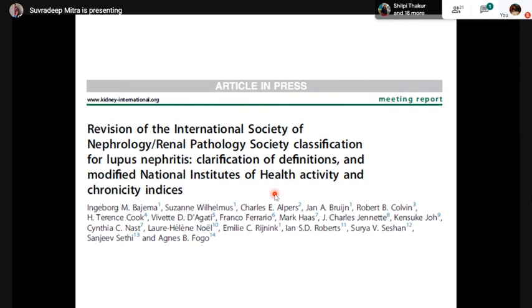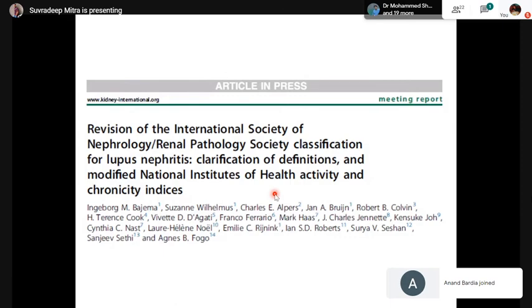So with this, let me tell you that lupus nephritis is histopathologically classified into 6 classes. The first class is the minimal mesangial, which means that morphologically you barely see anything. It's kind of normal morphology. However, when you do direct immunofluorescence, you tend to see a full house pattern restricted to the mesangial component, and sometimes you can see a little bit of paramesangial deposits as well.